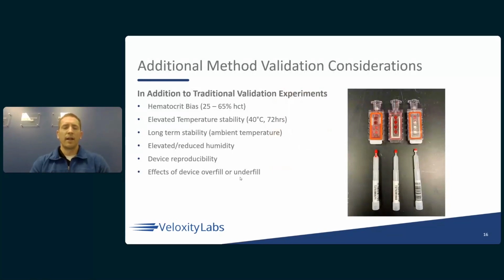Excellent. So that's high level on what we go through as we're developing methods. And then in addition to that, with microsampling devices, there are some additional experiments and considerations you need to take into account that are different than traditional plasma specifically, but also whole blood.